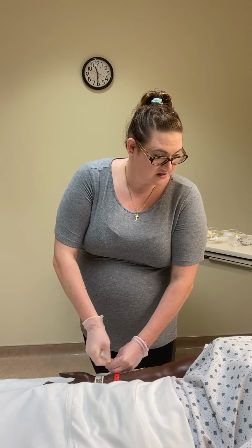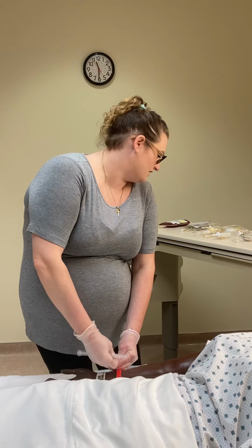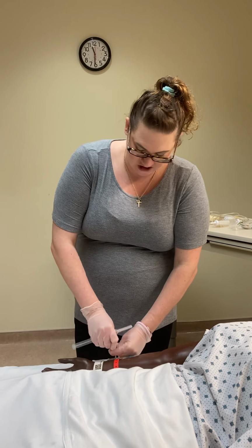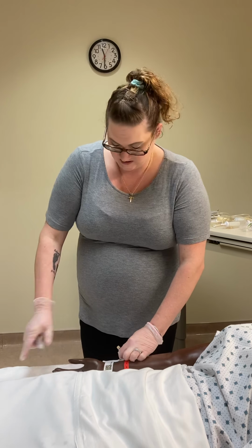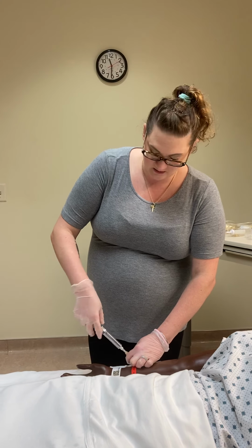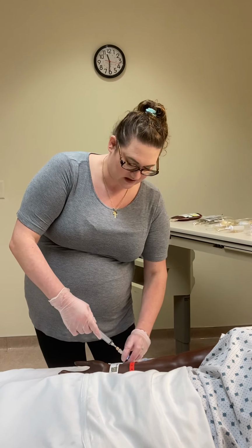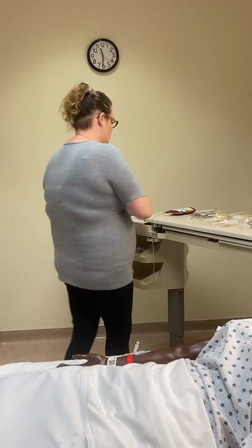Do you know what your blood type is? And a lot of patients might not know it. So we're going to have to look at her chart. And it says that she's B positive. All right. So I scrubbed for 15 seconds. I'm connecting. I'm going to aspirate for blood, and I get it. And then I'm going to slowly flush. And I'm just going to clamp it back up for right now. This is going to go into my sharps container.